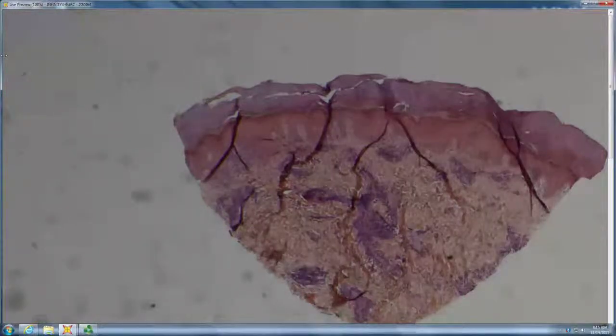Because a biopsy of TA is a temporal artery biopsy, which is going to be little round things, because they take that temporal artery and cut it into little round circles. So if you've got 20 little round circles on your slide, that's a TA biopsy. So this is more likely to be PAN. Yeah, PAN. It was a patient who presented with livedo and got a biopsy, and that's polyarteritis nodosa. There is lymphocytic macular periarteritis, which is livedo, and it's all lymphocytic, and that's early PAN. Those people evolve to PAN.